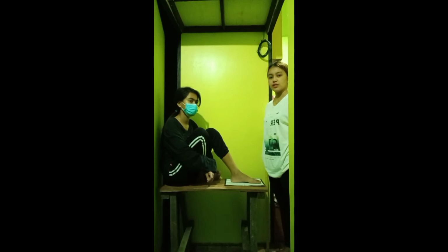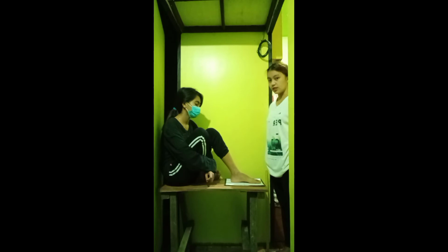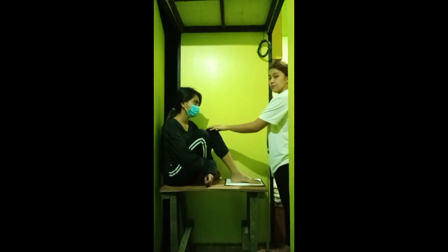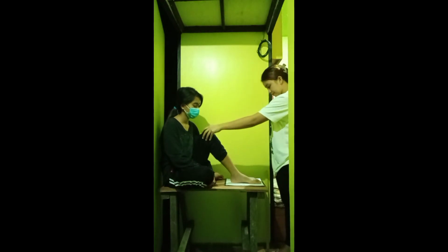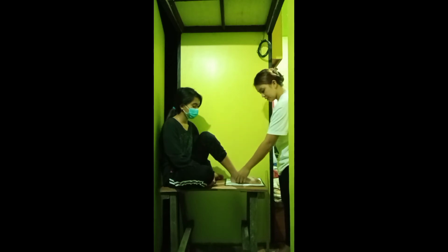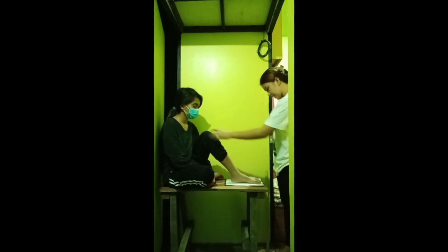The next projection is the AP oblique medial rotation. The position of the patient is still the same as the AP or AP axial projection of the foot that we did earlier, wherein the knee of the patient is still flexed and the foot is in contact with the IR, but put it in your mind that the patient's foot must be rotated 30 degrees medially or internally. The foot of the patient should be centered before you rotate it 30 degrees internally.